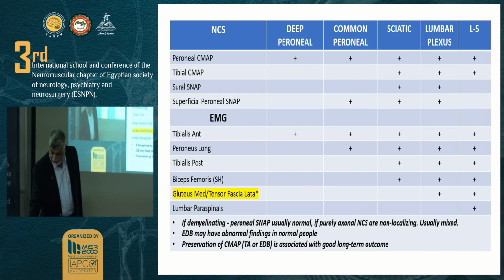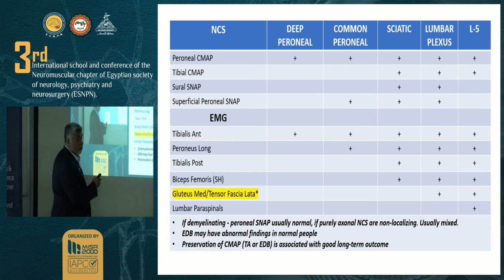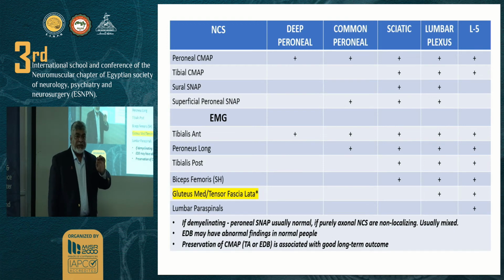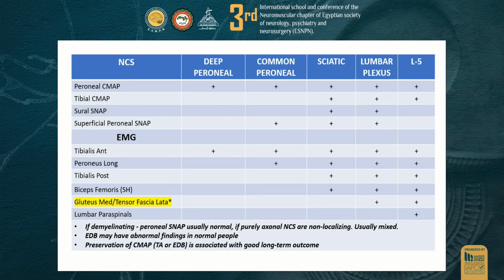Okay. Here's our EMG plan for this patient. We check the peroneal motor CMAP. Of course, it will be affected in all the conditions if we check at the EDB, but remember that in foot drop, it's mandatory that you check tibialis anterior. So we check the CMAP over here at the small muscle that's called EDB. We also check at tibialis anterior. It's very critical to check the tibialis anterior muscle, nerve-wise, conduction-wise, as well as needle-wise.